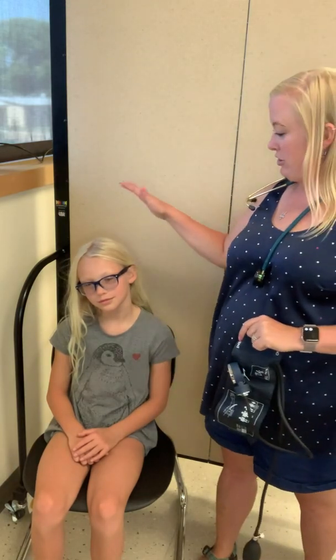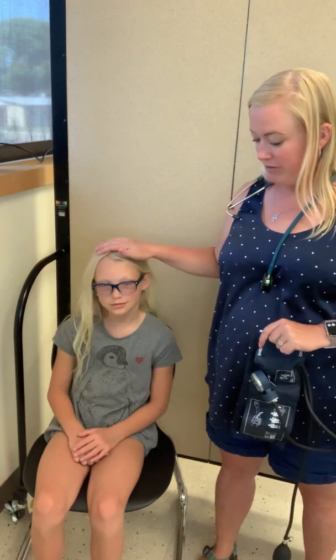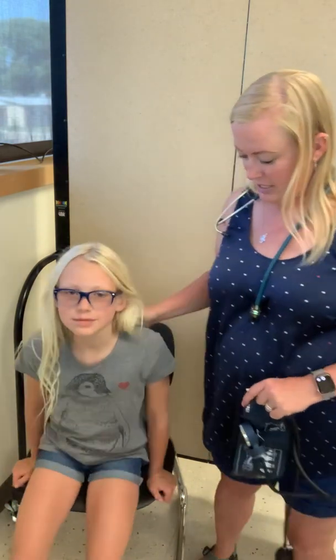So we want to make sure that her feet are on the ground flat, and that she is sitting upright in a nice position just like that. She also needs to make sure that she doesn't need to go to the bathroom because that can negatively affect blood pressure.